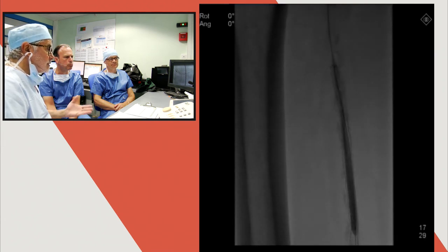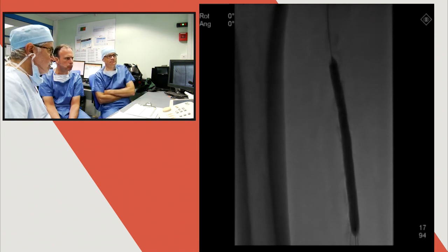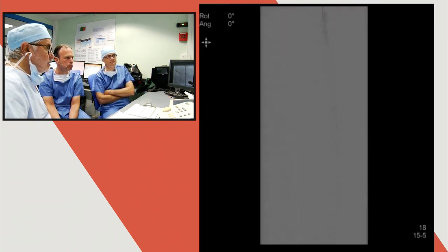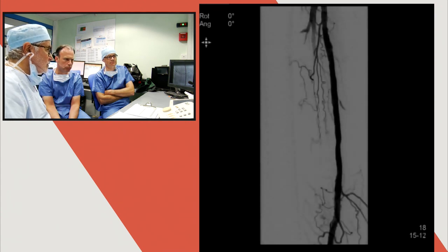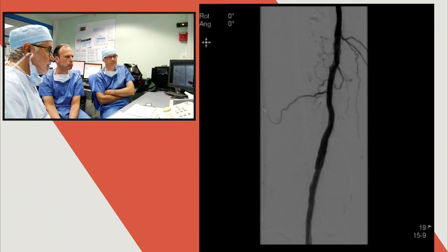You see the result again, precisely showing that there is no residual stenosis. And we did a final assessment showing an excellent result all along the SFA with the Eluvia stent and the former stent, and we see that everything was okay.